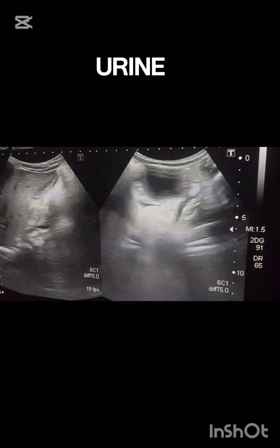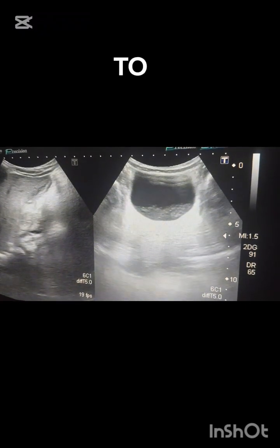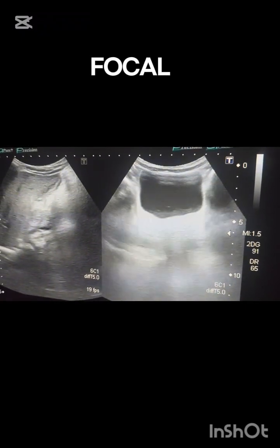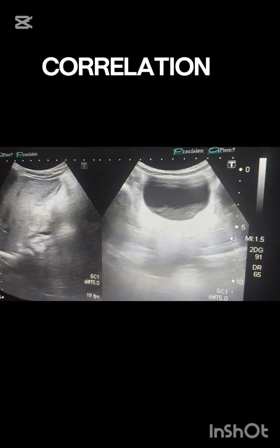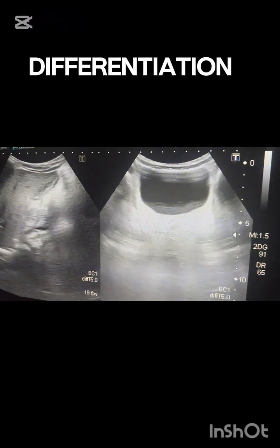Post-void residual urine should be assessed, as incomplete emptying may predispose to recurrent infection. In some patients, localized focal thickening can mimic bladder mass. However, correlation with clinical symptoms and urine analysis helps in differentiation.